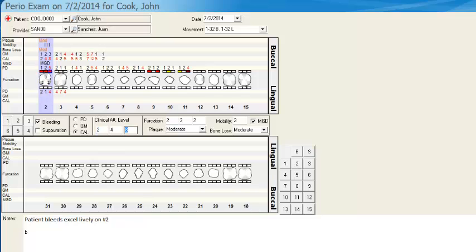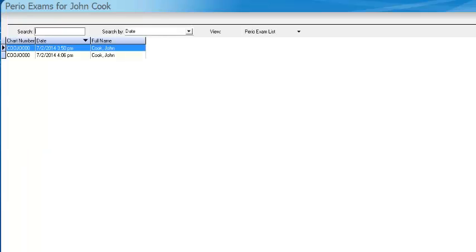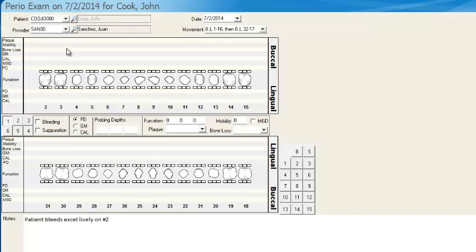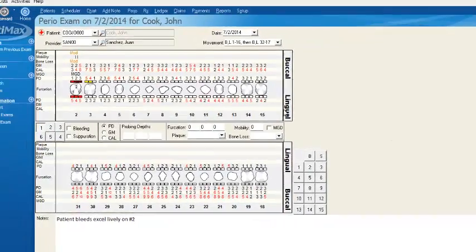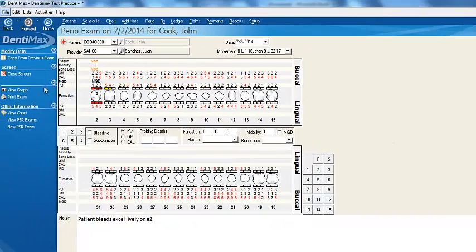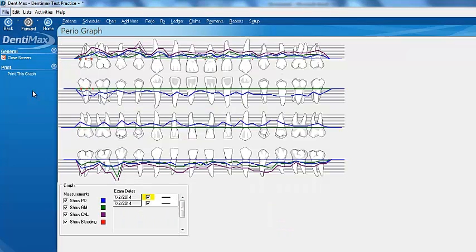Let's go ahead and save our changes. I'll go back to the other perio measurement screen and click on view graph. This is a wonderful way of graphically showing patients their perio measurements.